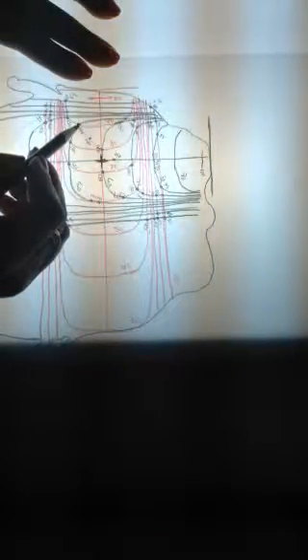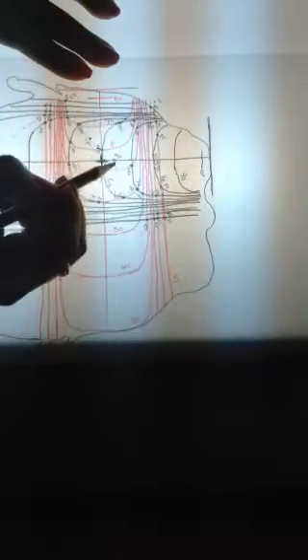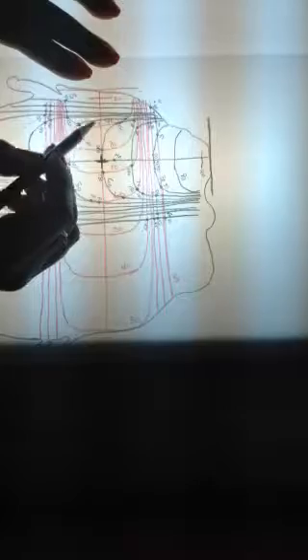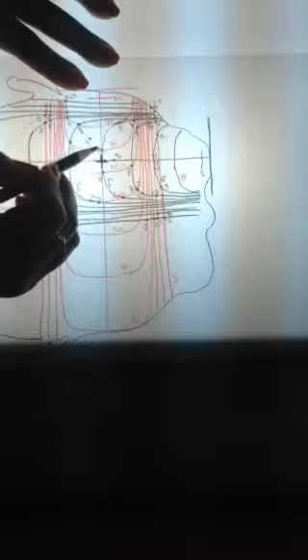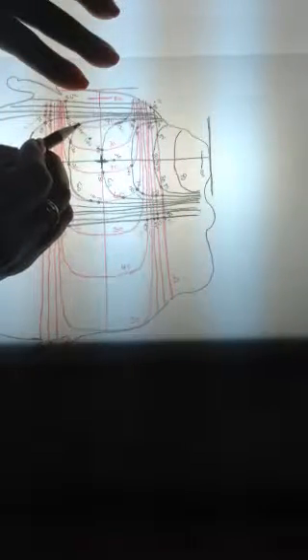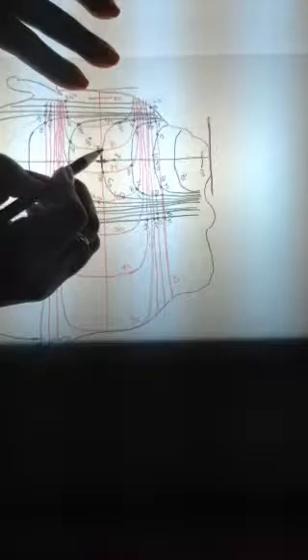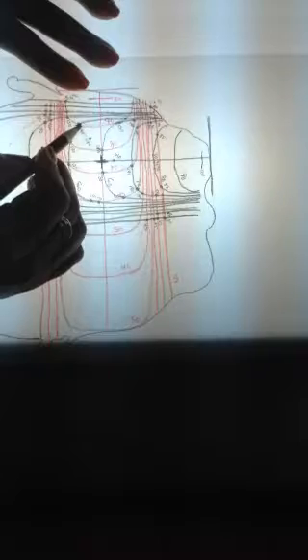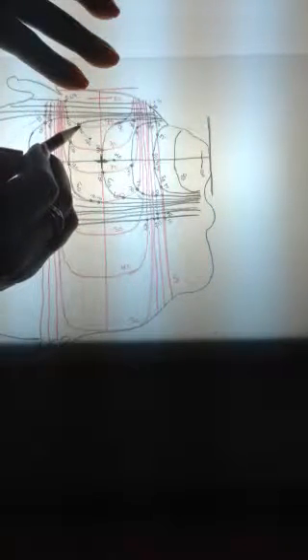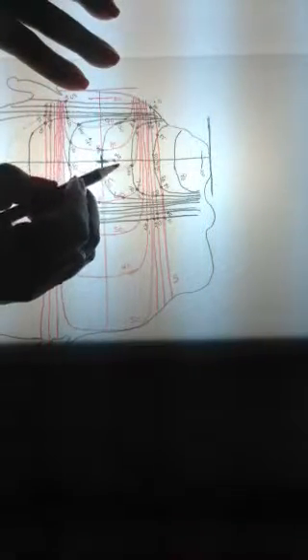So the question is, do those 140% dose points connect to each other? It looks like they should connect in this fashion. So in order, though, to come to that conclusion, we have to find out if there are spaces between the dots that would reasonably add up to 140%. So I had one intersecting point here, and another here, and another here that equaled 140. Would those 3 points connect together? They would if every point between those points could equal 140.